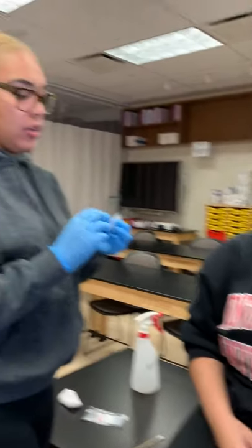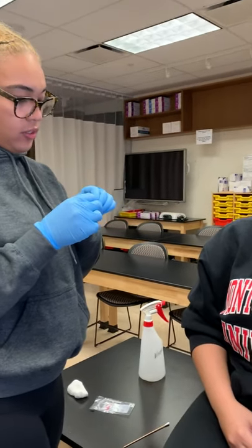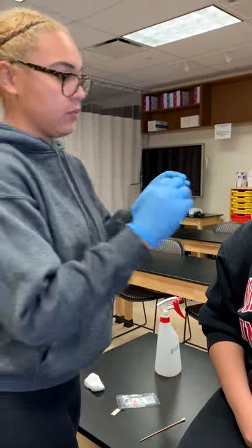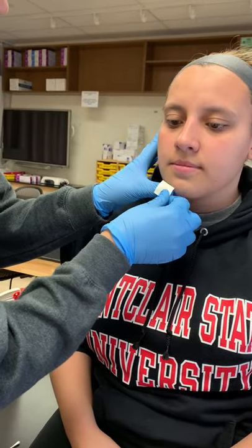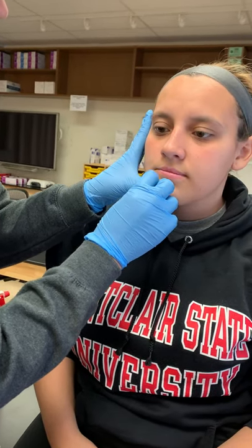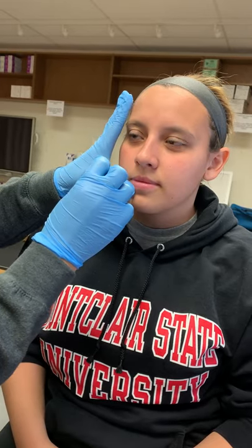Our Steri-Strip is right here. You're going to get stuck. Oh, I got it. That's going to touch your mouth. That's it.